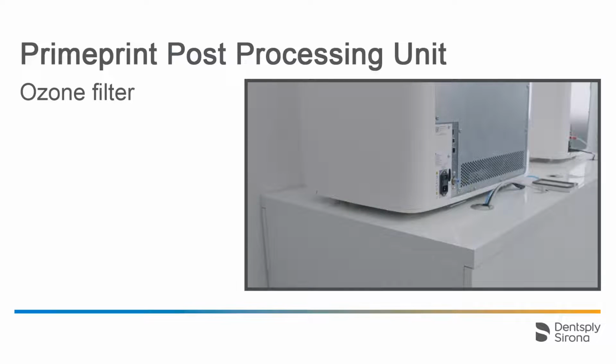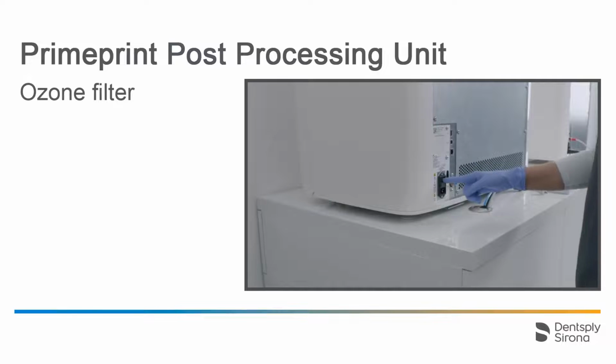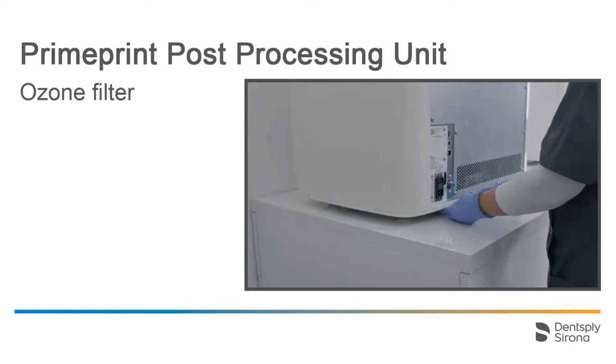We proceed with the ozone filter, which is also a consumable part and should be exchanged after the display shows a message to this effect. The filter is located on the back below the device, and we also make sure the device is unplugged beforehand.